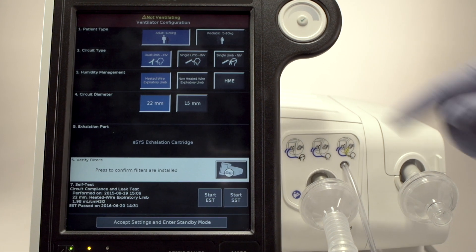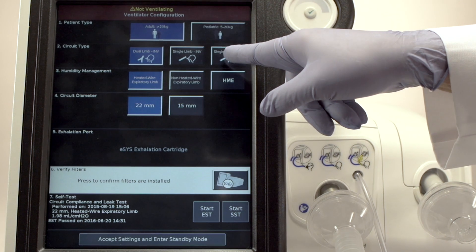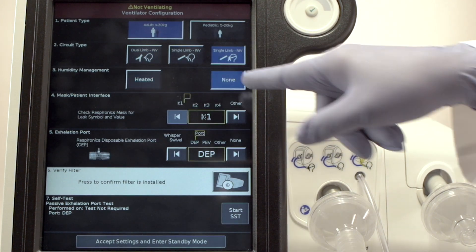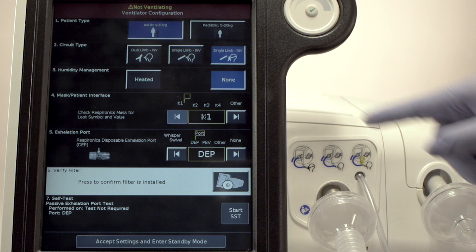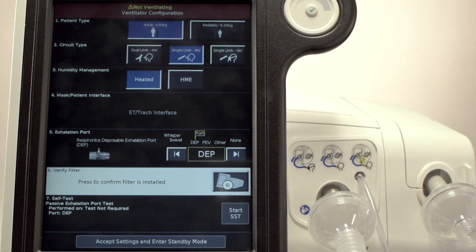Select Adult Patient, Single Limb NIV, and No Humidity Management. Note that we could also have selected Single Limb Invasive Ventilation, and the rest of the settings would change to accommodate this circuit type.